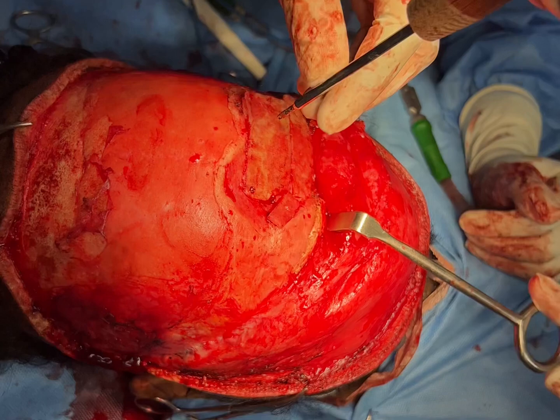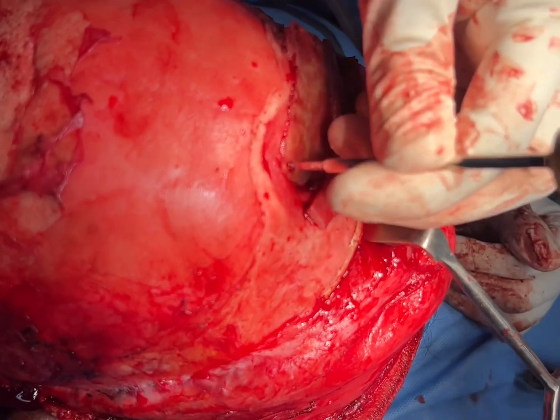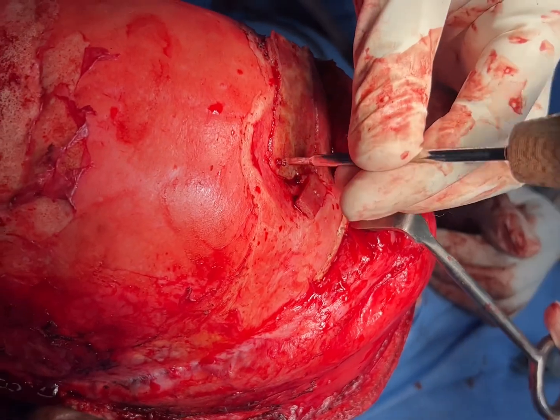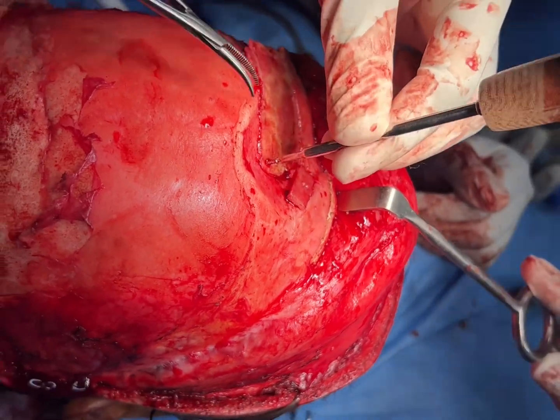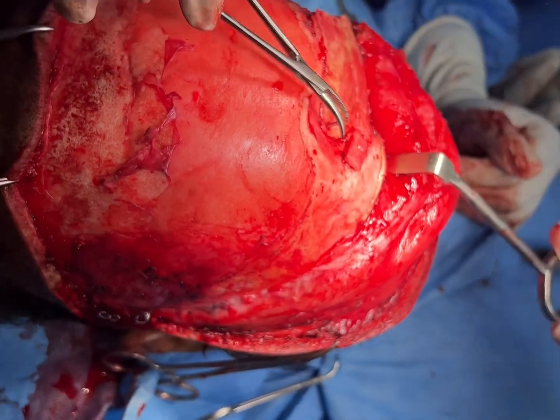We're going to remove the last of the screws now.